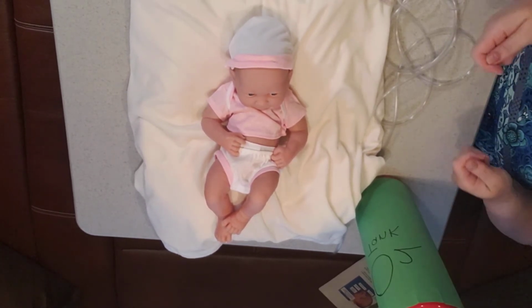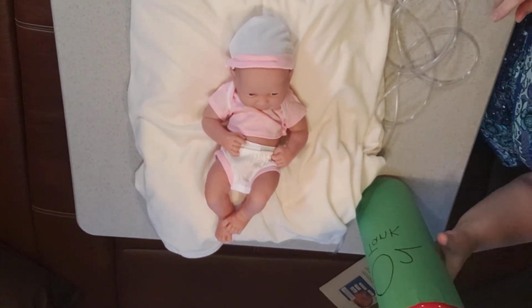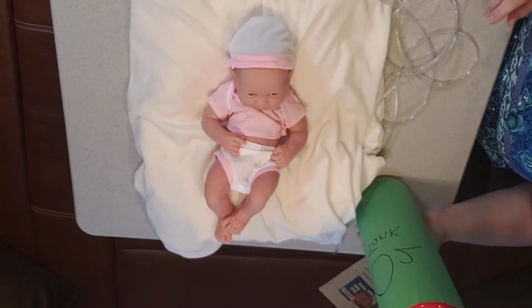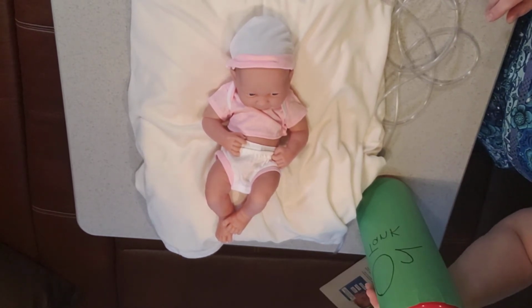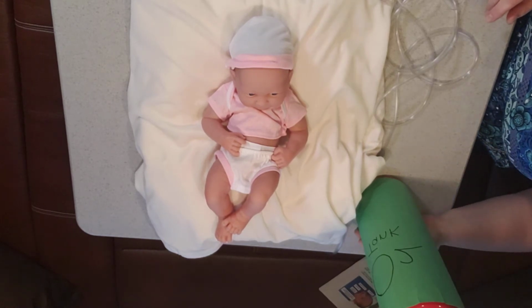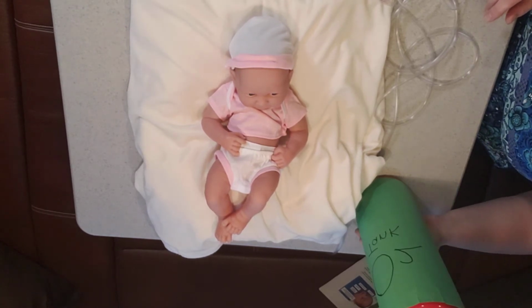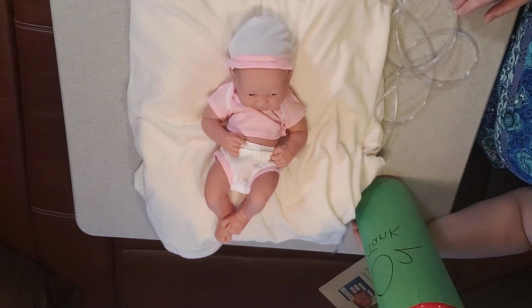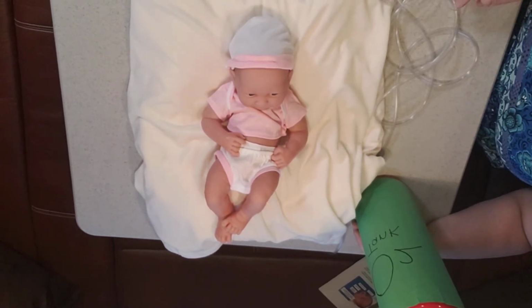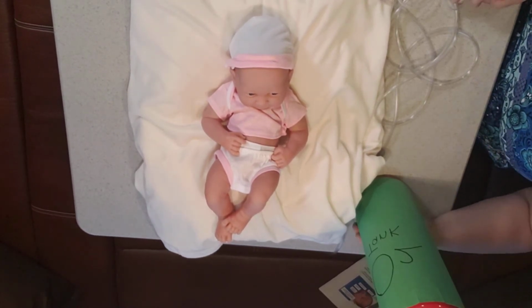So it'll come with a little case. Make sure it's zipped up and laying on the floorboards of the car. Also, you don't want to keep it in a room where somebody's smoking or anything that could cause a spark in the bedroom or anything that has like hot oil. I know you're working in auto. I'm an auto mechanic. Auto mechanic. I'm sorry. And so you probably do use some flammable materials. Yeah. So you understand, I'm sure. You want to be careful.